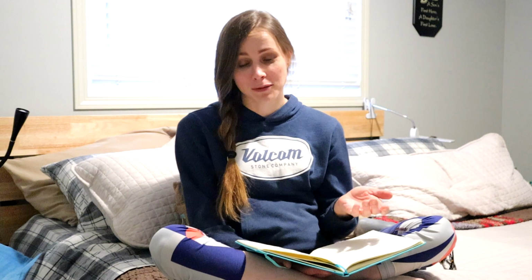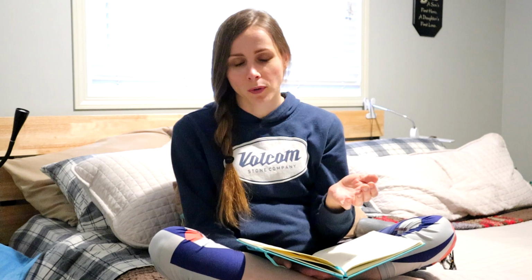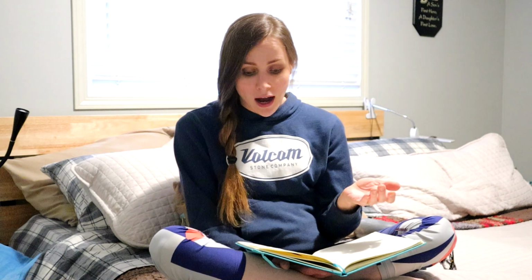The cons of intermittent catheterization are that you have to carry all the catheters with you, which is super annoying sometimes, and that can get expensive because if you're like me and you're not reusing catheters, I luckily have insurance, but if you're paying for them out of pocket, then you have to pay for a new catheter every time. If you're not paying for a new catheter, you have to wash catheters. And that's annoying too. So you have to have multiple catheters in order to be able to do intermittent catheterization.